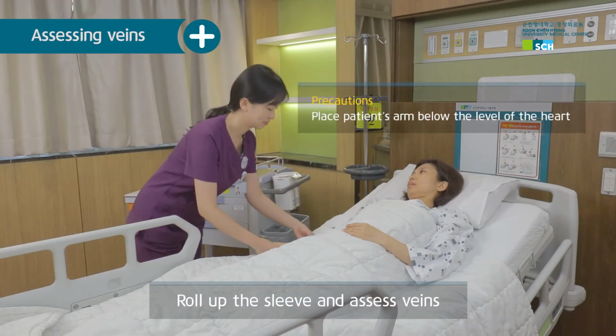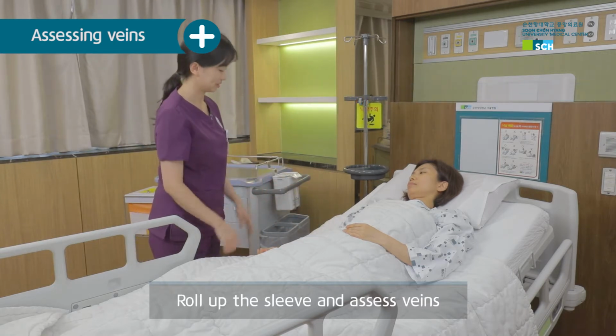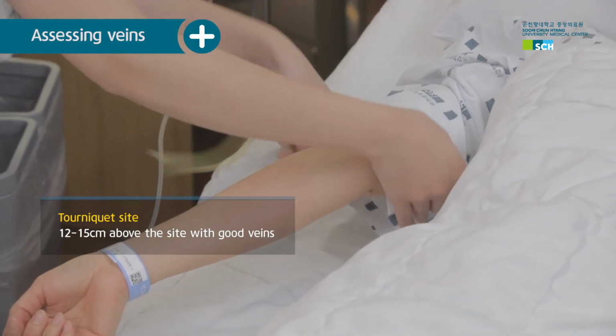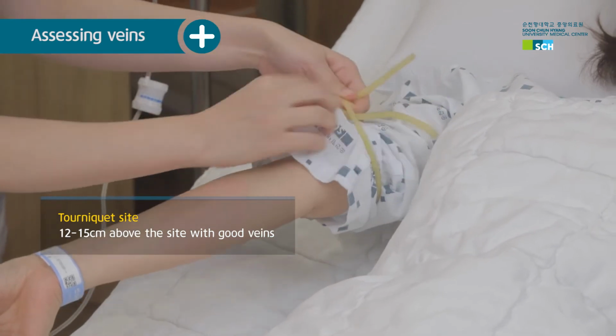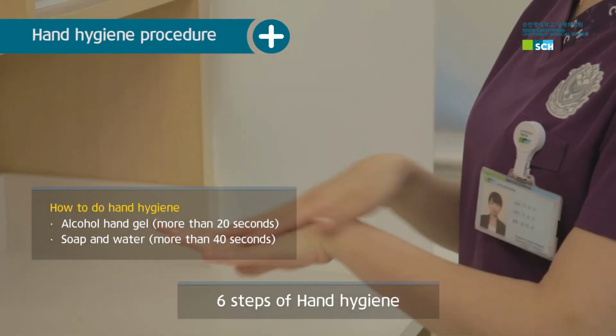Assist the patient to be in a comfortable position with their arm placed below the level of the heart and assess the vein. Apply tourniquet 12 to 15 centimeters above the site with good veins. You should choose the injection site where the veins are prominent and straighter than the catheter to be inserted. Perform hand hygiene.